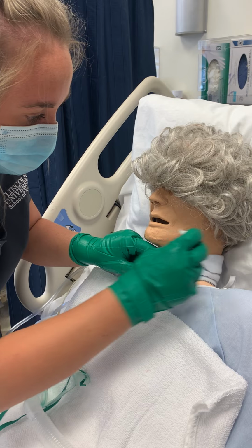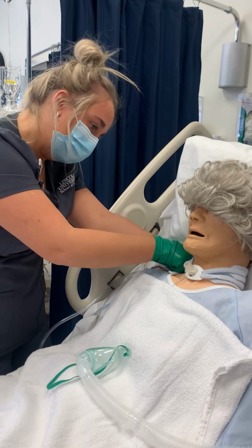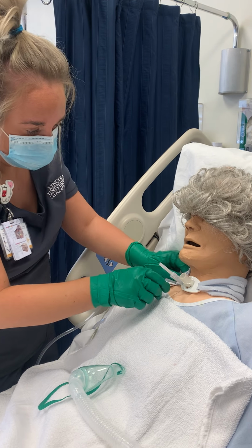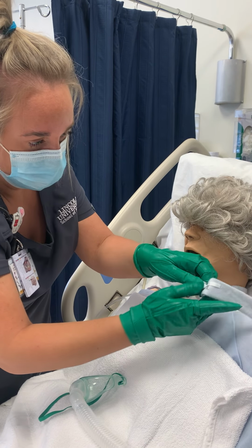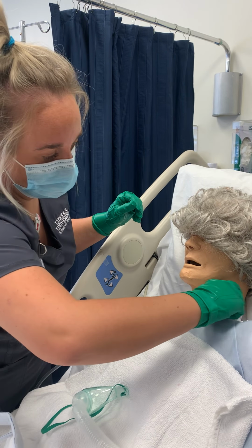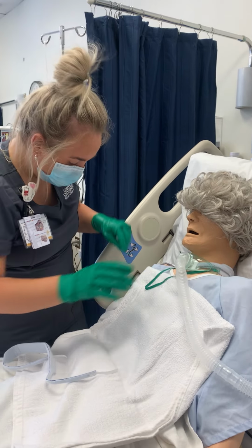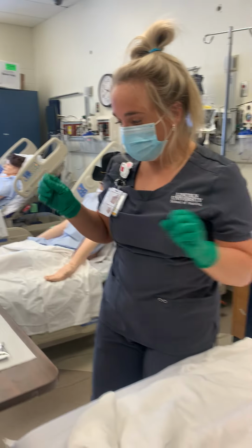Making sure I get this new one on. Now I can go ahead and remove the old one. Just making sure I'm checking on her, making sure she's doing okay, doesn't need a break. Okay, so now I'm gonna check, make sure I can get 2 fingers under this one and make sure it's tight enough. Everything looks good. Put oxygen back on her. I dispose of the old trach tie.